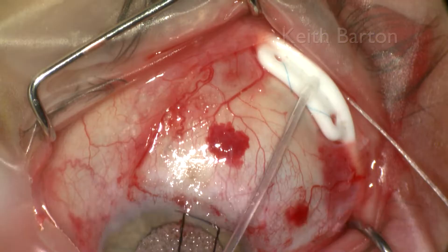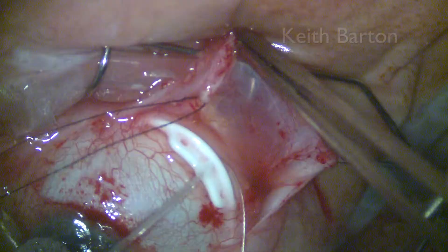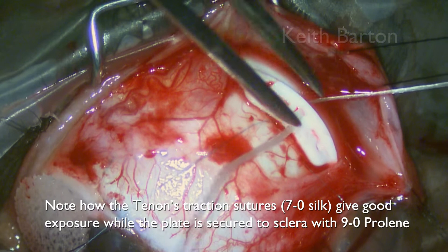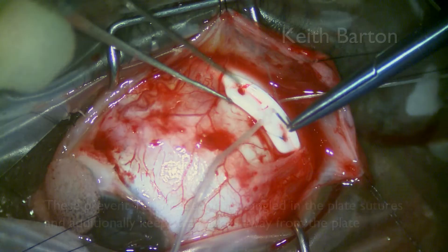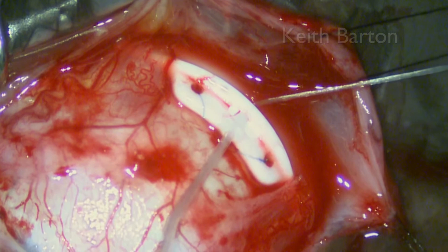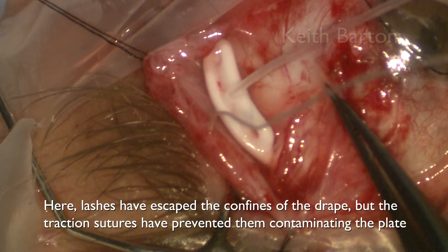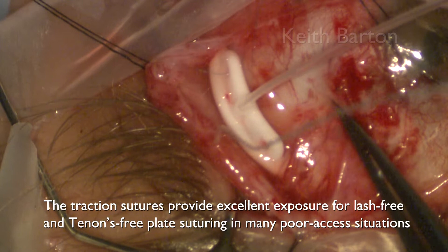After the plate is in place, Tenon's traction sutures improve access so that the plate may be sutured tightly to sclera. Secure the plate using non-absorbable diagonal sutures as illustrated here — these minimise both lateral and anteroposterior plate movement. Note how the Tenon's traction sutures, which are 7-0 silk, give good exposure while the plate is secured to sclera with 9-0 prolene. These prevent Tenon's becoming tangled up in the plate sutures and additionally keep stray eyelashes away from the plate. The second plate suture is the more critical one as it compresses the plate against the first suture, affording a very tight scleral fixation. Tight scleral fixation is important as it reduces micromovement of the plate and enhances biocompatibility of the implant, reducing encapsulation.